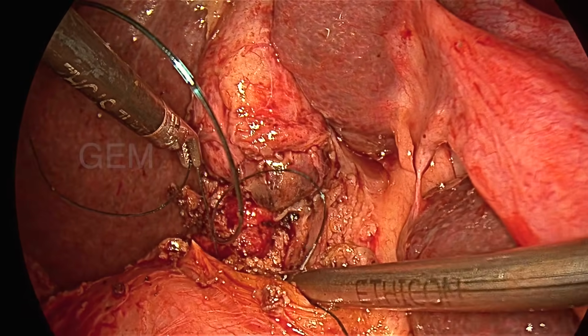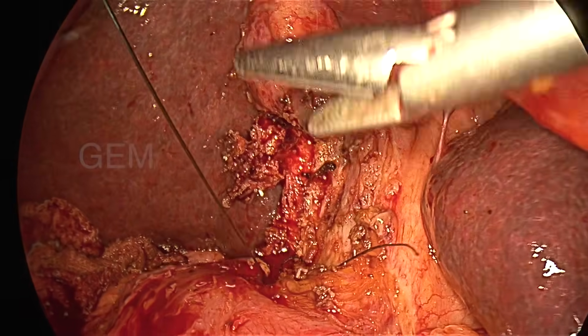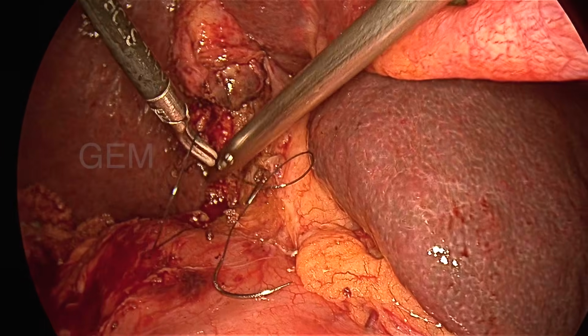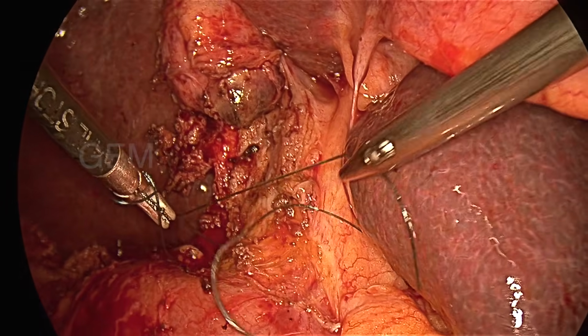So now what I have to do, I am going to give a thorough wash, and then I am going to keep a fresh gauze piece, because this gauze piece may be bile stained. So after the removal of the gallbladder, I am going to check the gauze piece whether any bile is coming out or not.